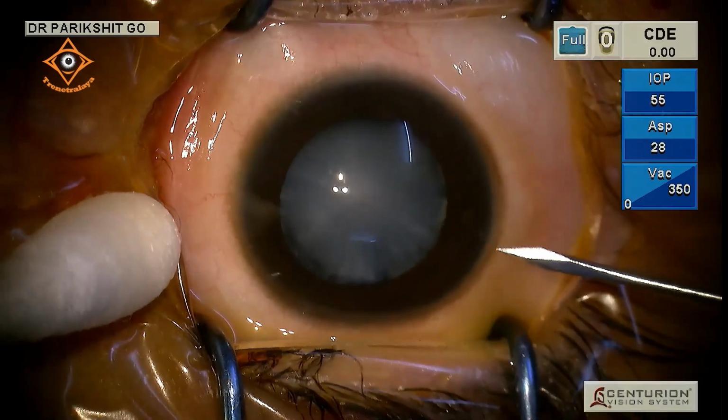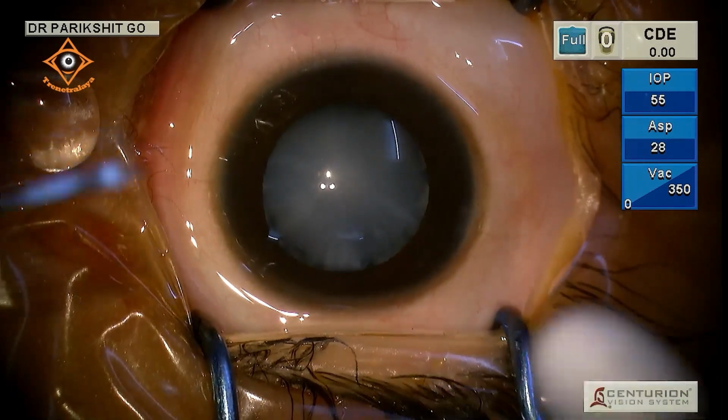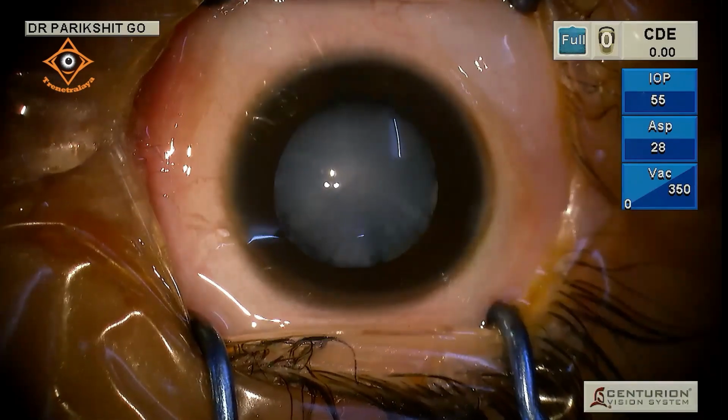Now, that's interesting, because if you're not covering that eye, you can have a problem. So you must be covering that eye with a patch. Yes, sir. I give a patch, sir, always. And can I have a trypan blue?